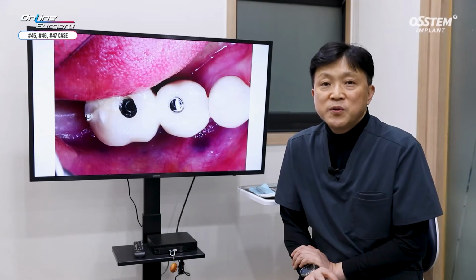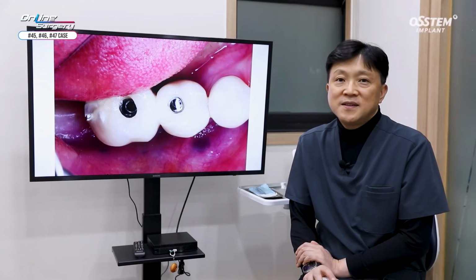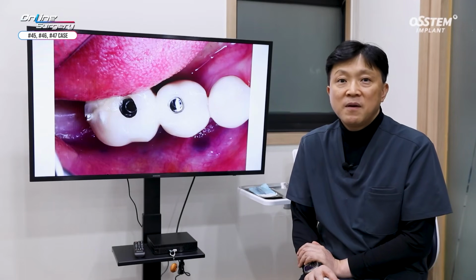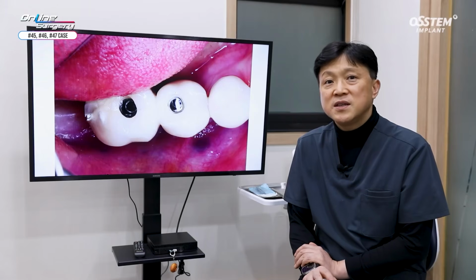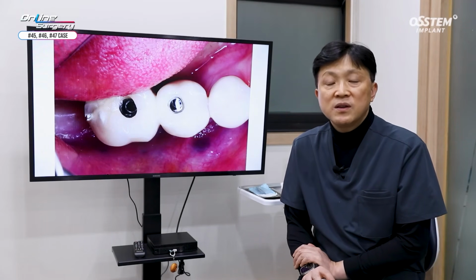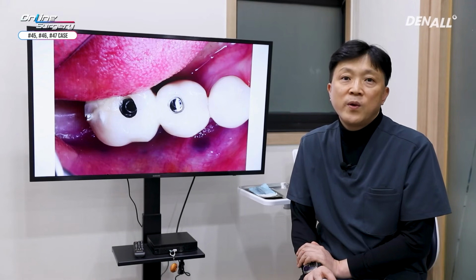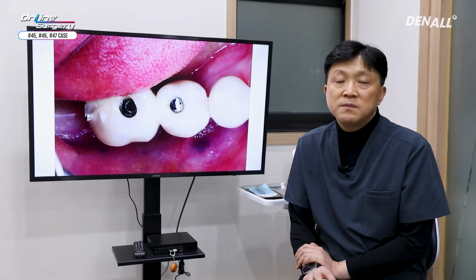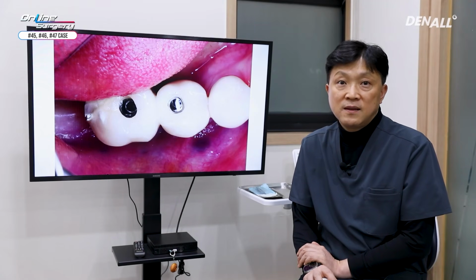How did you find the surgery video? You may find it quite complicated. When a problem occurs on hard tissues around an implant and results in biologic complications, we are actually left with no better options but to remove the implant and replace it with a new one. That is the most predictable solution, but given that it is time-consuming and also causes patient discomfort, it might not be the best option. But I thought that is the only solution available for this situation.